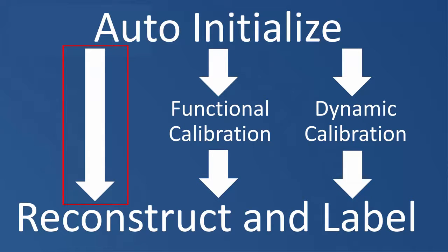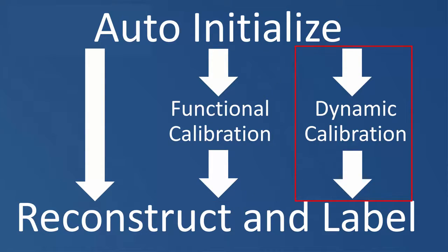The remainder of this video will be split up into three sections. The first workflow is where we will be using the static calibration, which we have just completed, to auto label a trial with a small range of motion. In the second workflow, we will be performing a functional range of motion calibration, and then using the functional calibration to auto label a dynamic trial with a larger range of motion. And in the third workflow, we will be using a dynamic trial as our functional calibration.